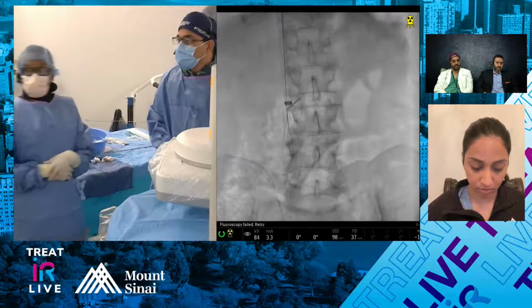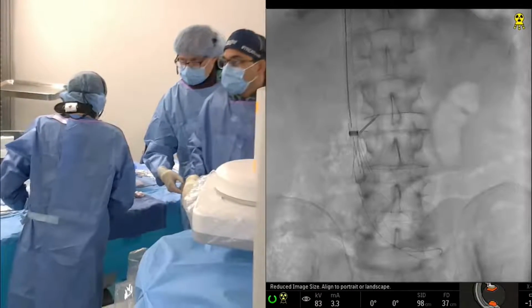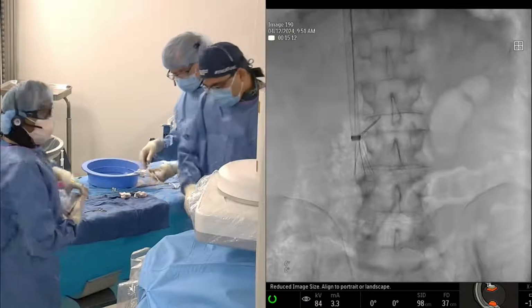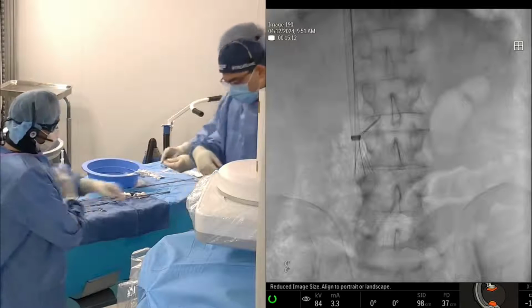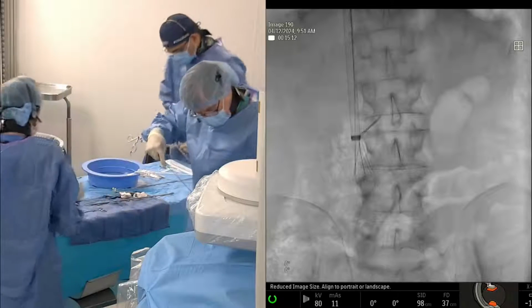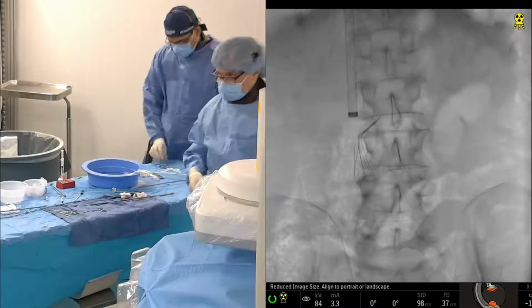No, my protocol has really been to just keep these patients on the anticoagulation. I leave them on it during the procedure, and even afterwards I ask them to continue it, because we don't want things like clot building up on our system. Even if they're not going to be on it anymore, I leave them on it for another 2 weeks afterwards.